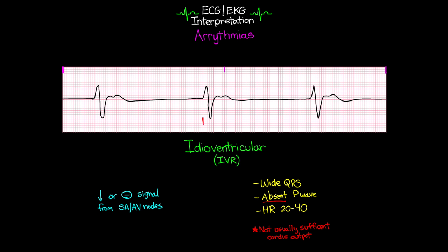Looking at our example here, you can see we've got that really wide QRS. You can see there's not any P wave anywhere around here. And counting this out, we've got a heart rate of 30. Therefore, we can definitely identify this as an idioventricular rhythm. Now, just like with our junctional rhythms, sometimes you're going to see faster heart rates than what's normally within that intrinsic ventricular rate, and we do have a couple other variations of this that we're going to talk about.